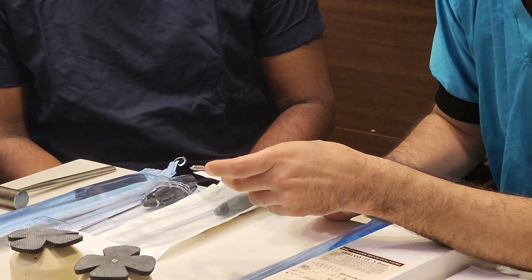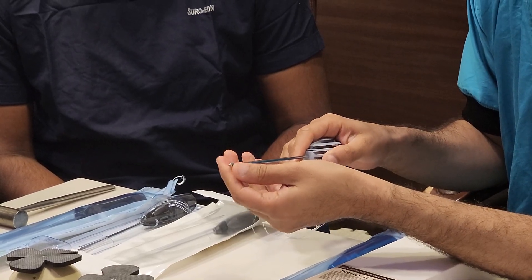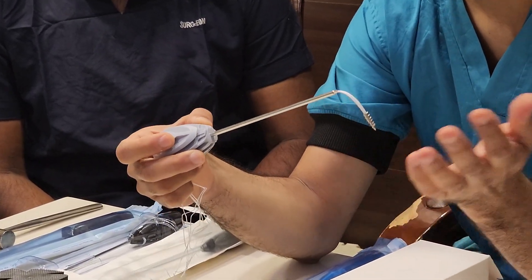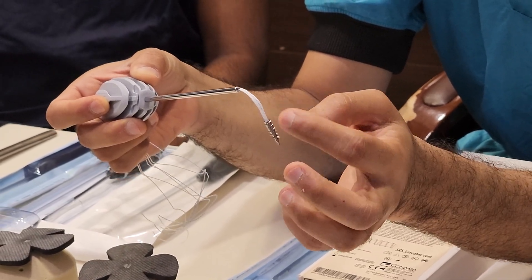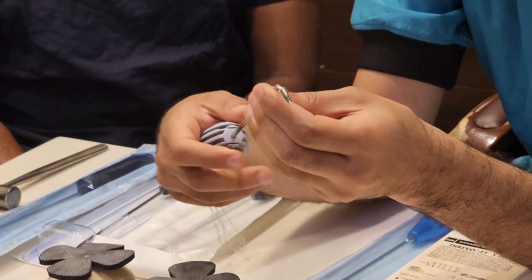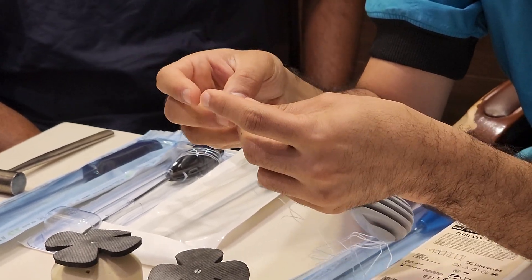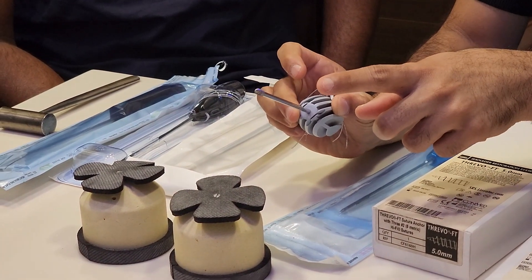This anchor is a fully threaded anchor. Normally in metallic anchors there is an eye and the threads pass through the eye, but in this particular anchor there is no eye — the suture passes into the threads themselves, all the way through to the tip. The anchor is made up of two parts, has a fully threaded architecture, and the anchor inserter is a screw head with no eyelet, so the fixation of the anchor is complete.